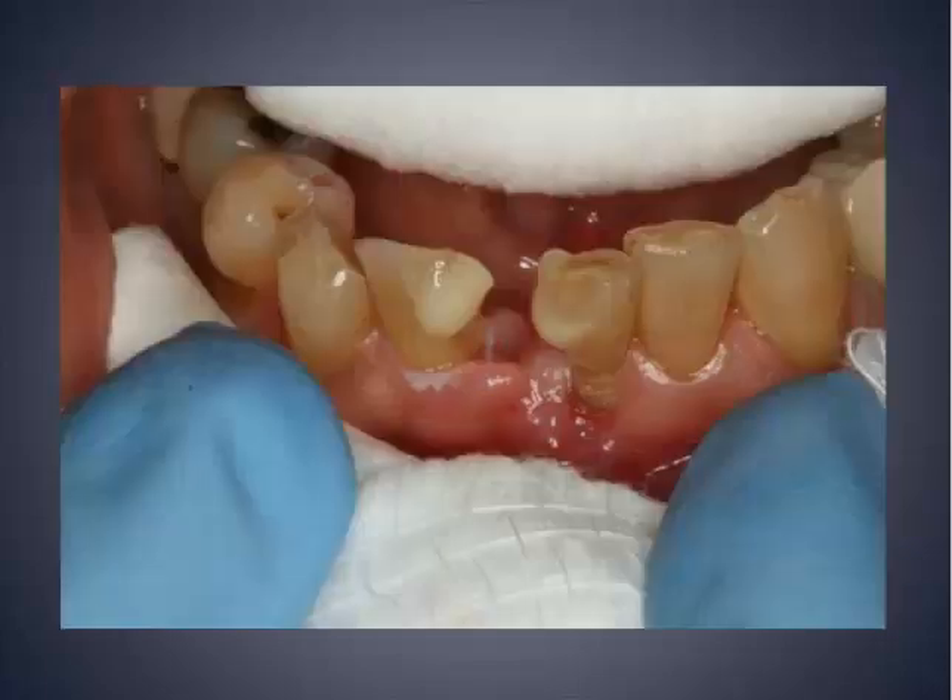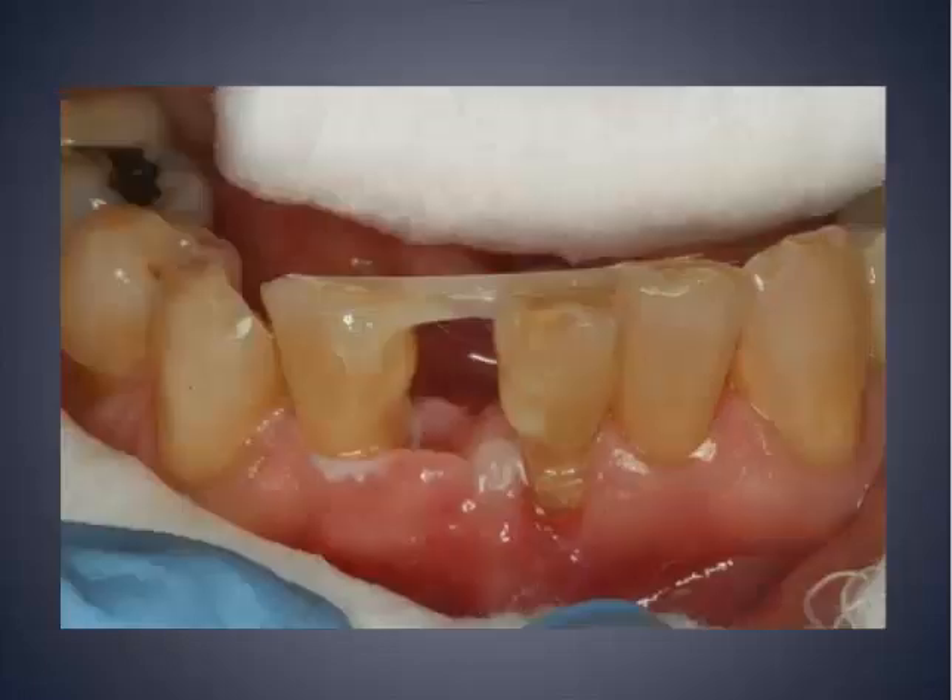I begin to take my Grandioso Heavy Flow. This is not cured — I've overlaid it here and it's just sitting directly on the teeth, exactly where you put it. That's the beautiful thing about these heavy flow flowables: exactly where you place them, they will stay. Now I take my Grand Tech fiber and overlay it — it looks like it's on the incisal but it's on the lingual of these anterior teeth. I light cure. When I light cure this, it becomes very hard. Those glass resin-impregnated fibers become very, very hard. Now I can use this as a mold or a base to begin building up a tooth out of my Grandioso Heavy Flow material.